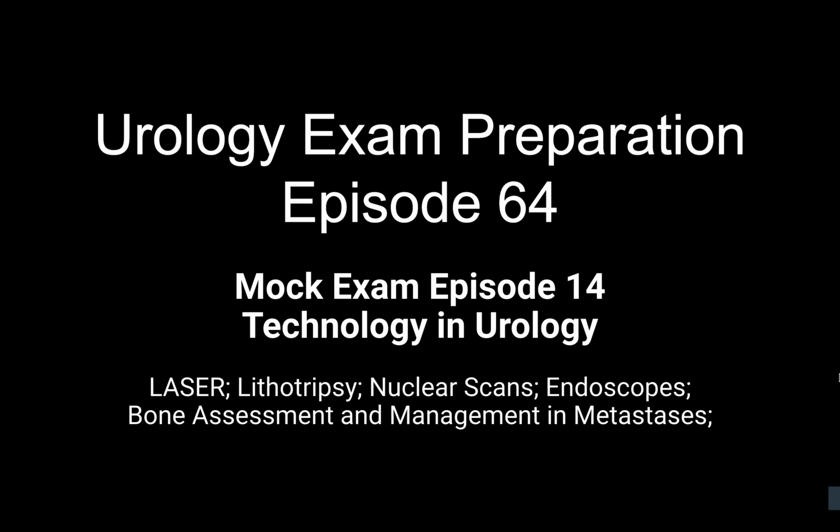Okay. And if given the choice to you, which laser machine would you buy for your department for both prostate and stones? If I have enough funds, I'll prefer a high-powered holmium laser because then I can use it for prostate procedures as well as stone. But if I don't have enough funds, I'll still buy a 50-watt holmium laser because that can also be used for HoLEP as well as stone and en bloc resection.